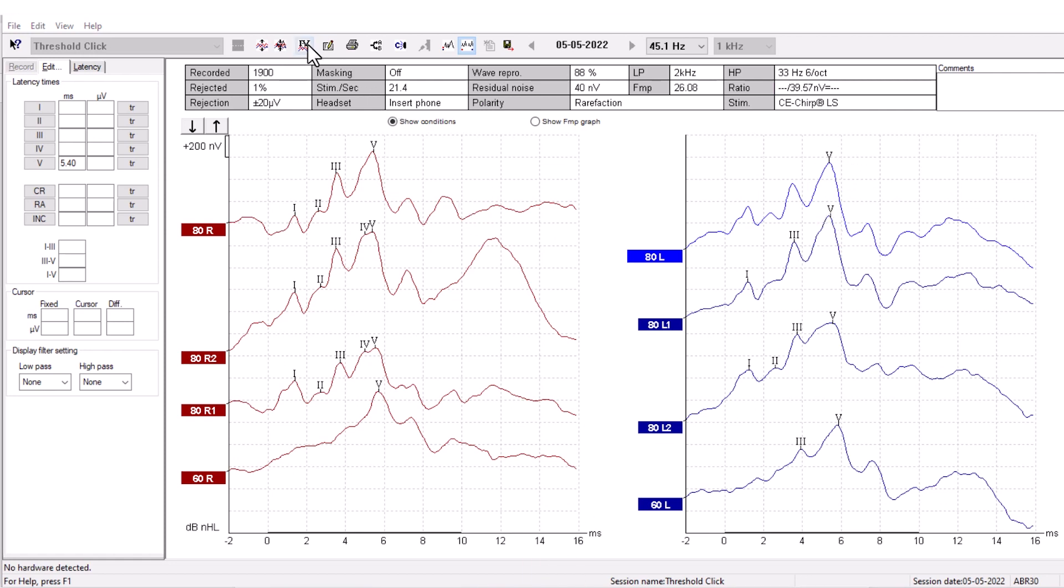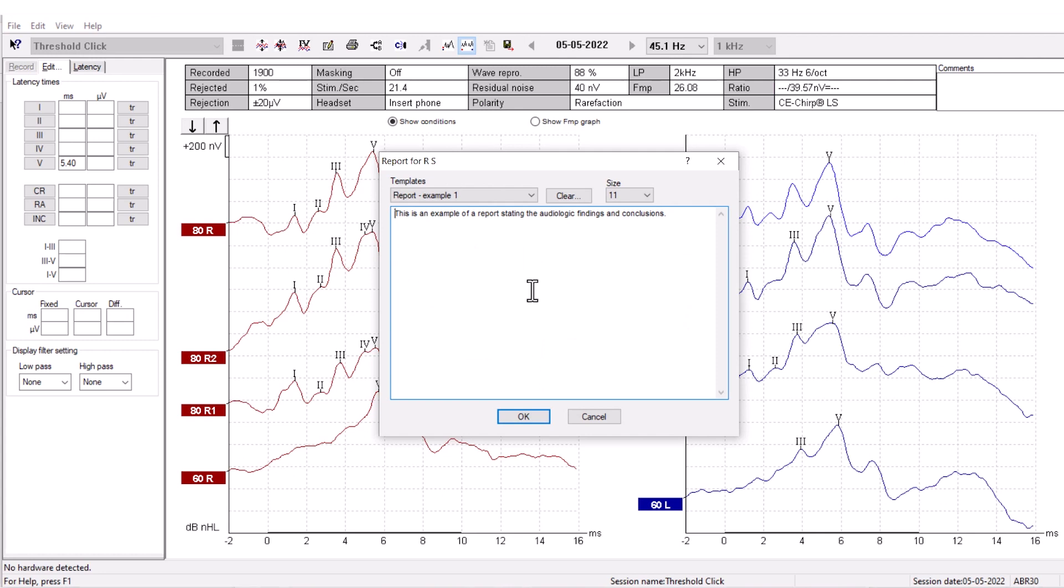Next to the Suggest waveform marker is the Note function. It allows you to write notes for the specific measurement. The notes are then included in the printout.